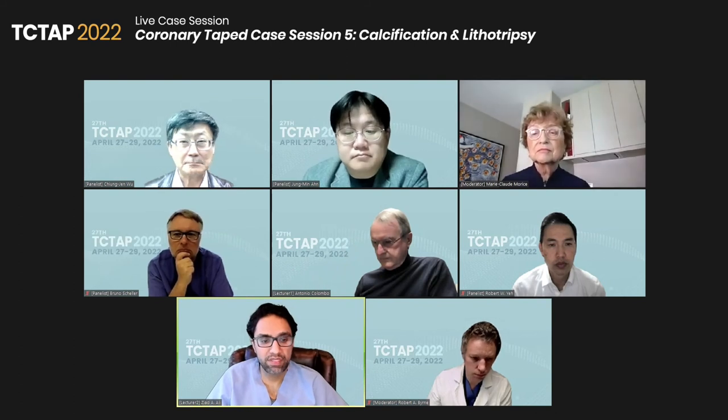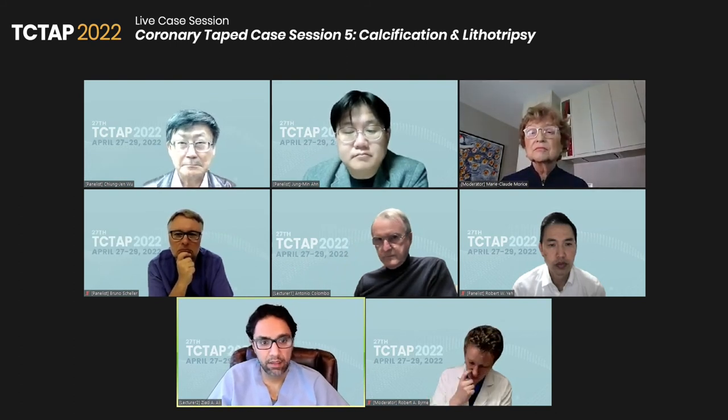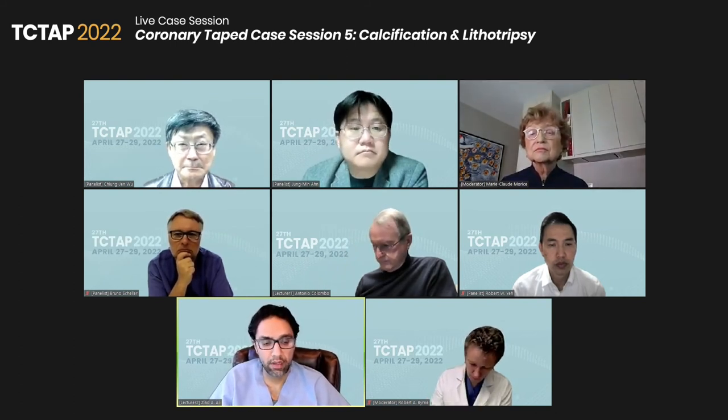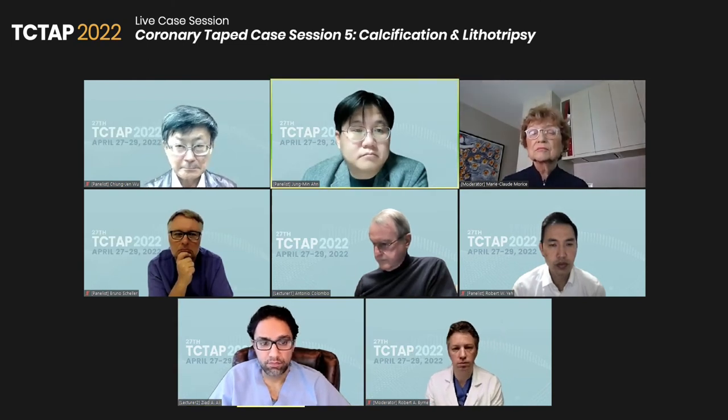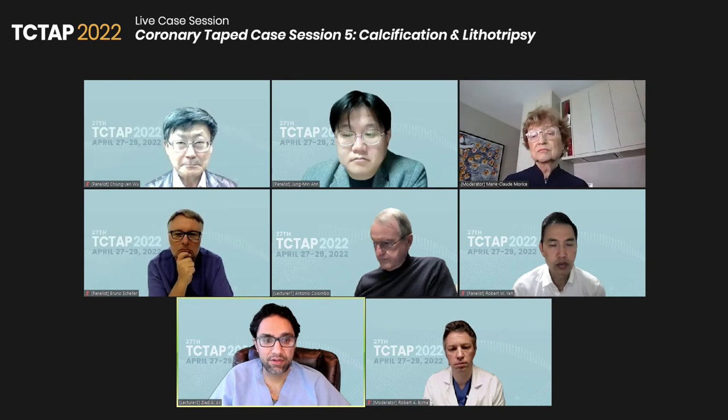So we presented this data at TCT in 2021. Whether or not you have a calcified nodule or an eccentrically calcified lesion, both the minimal stent area and the stent expansion, compared to the other groups, i.e. non-calcified nodule or concentric, are the same.